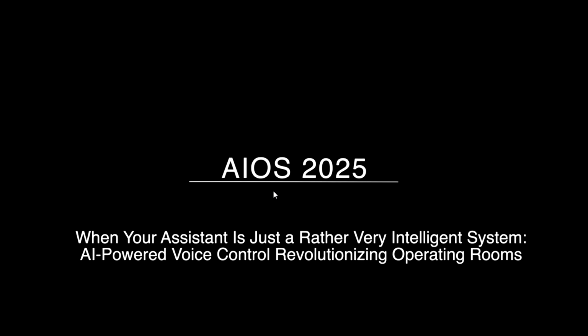Yeah, please start. So this is a video demonstrating how you can revamp and rewire your whole OT to make it completely automized.